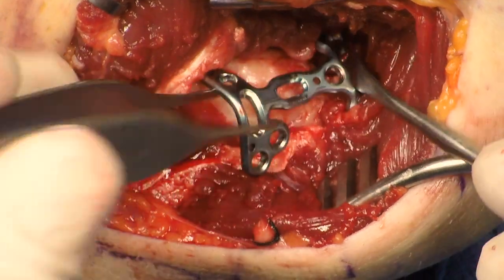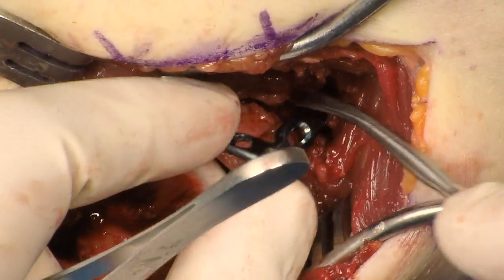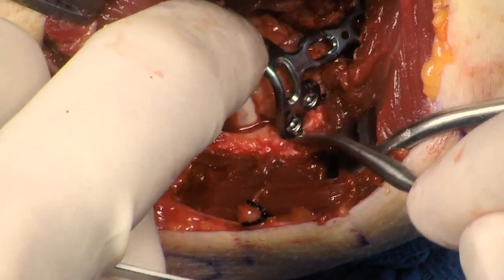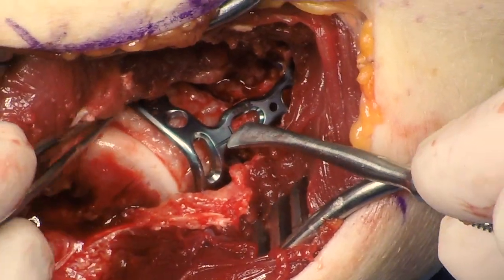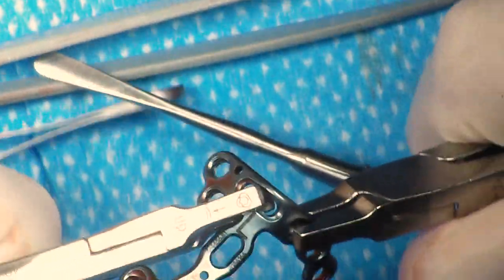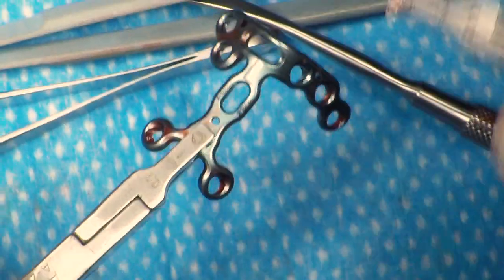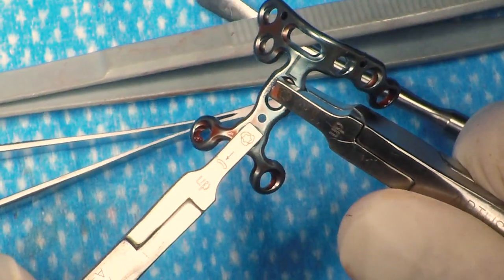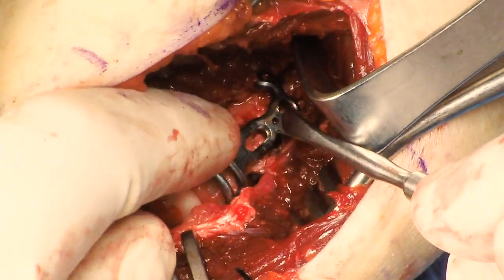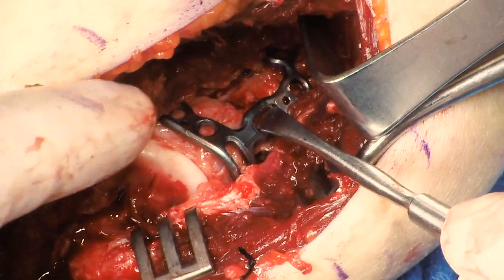The plate is then applied. An appropriate fracture reduction and plate placement is assessed. The determination is made that the plate needs a little bit of contouring. The plate is then contoured using the plate benders. The plate is then reapplied, and the appropriate reduction of the fracture and plate placement is confirmed.